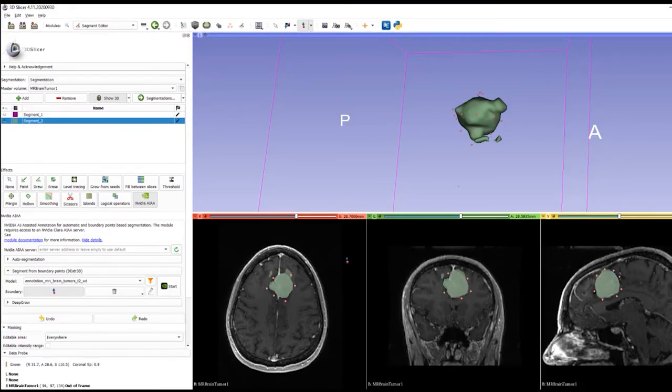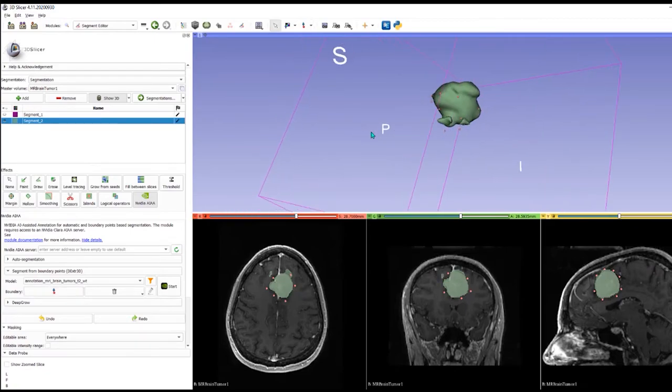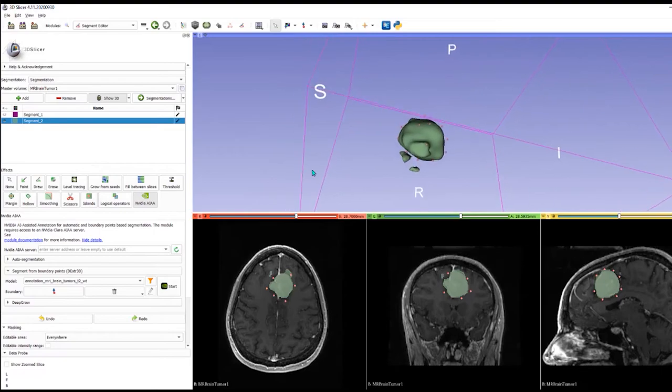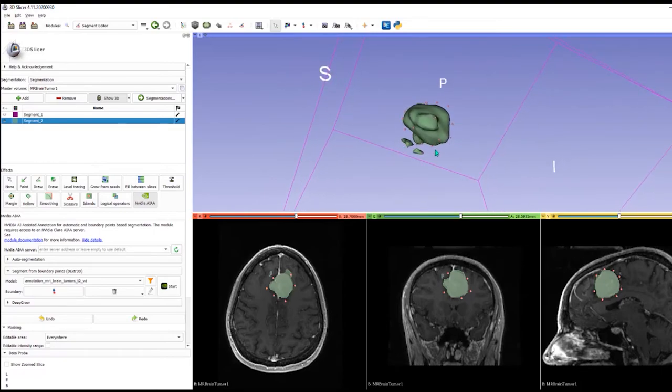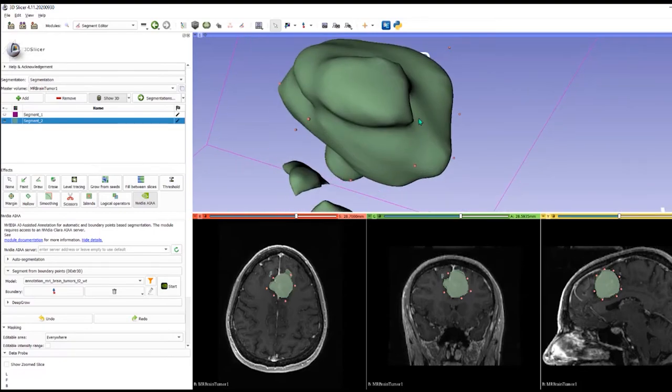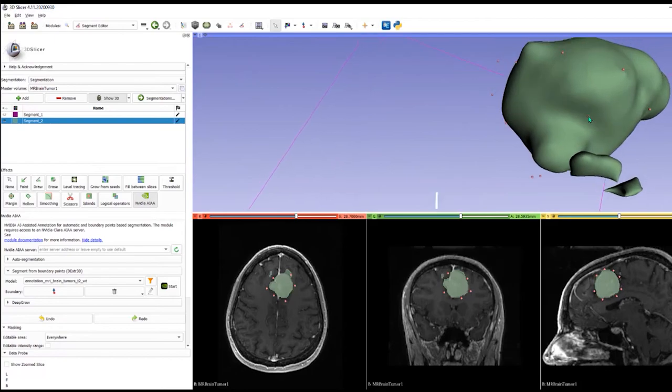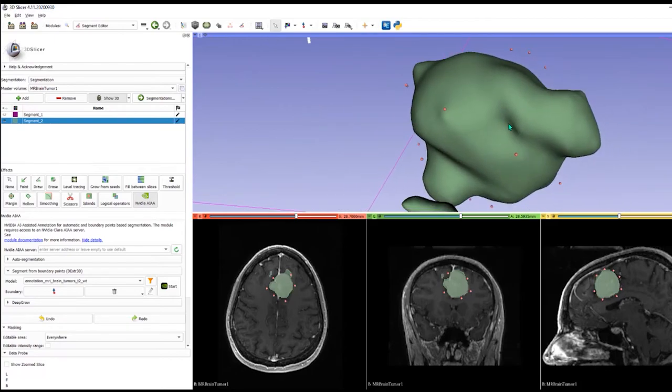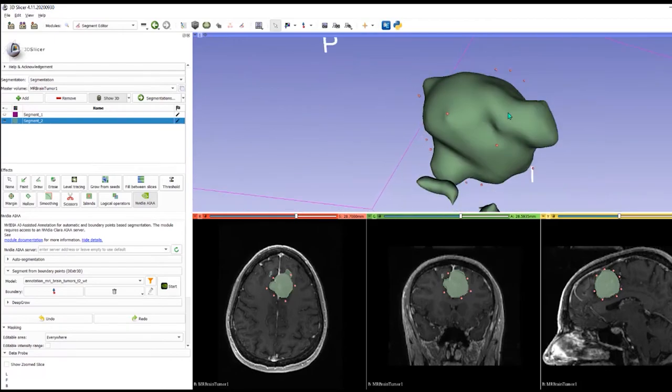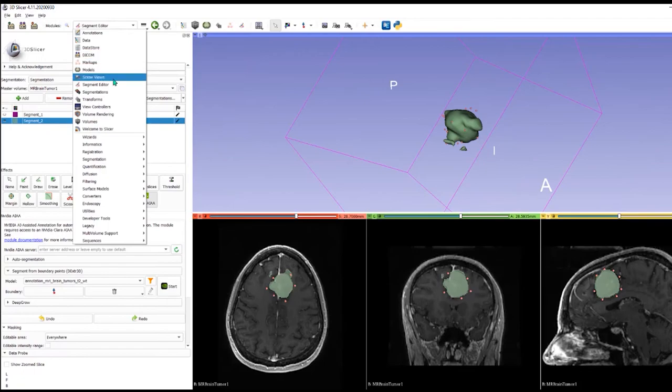Okay, and you see beautifully there it finds the tumor really rather well, I would say. There's a couple of bits there that we could cut out, but I think you would agree that's pretty damn good. If we switch back on the volume, we'll see it in position.